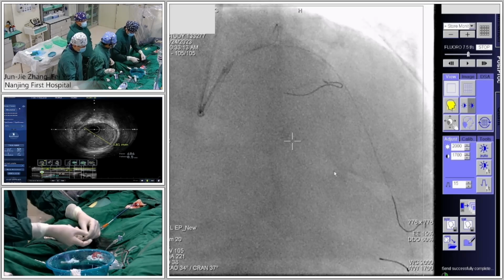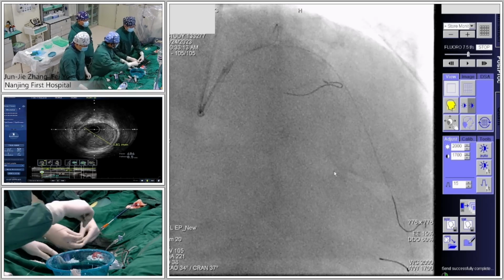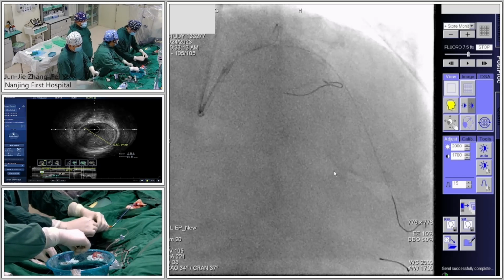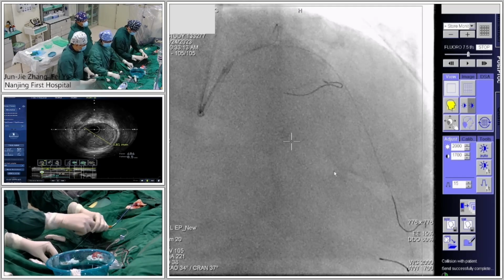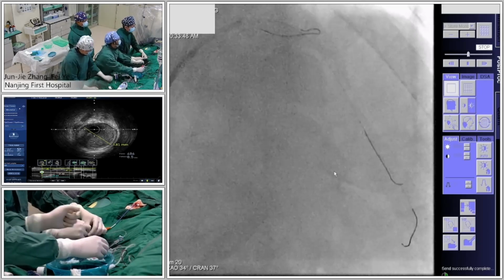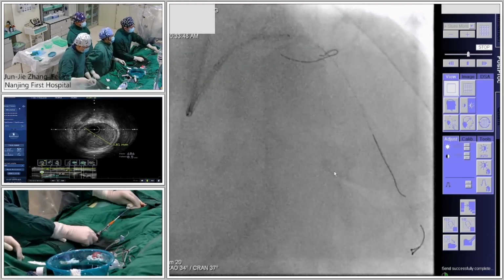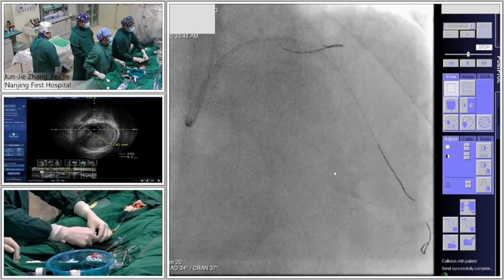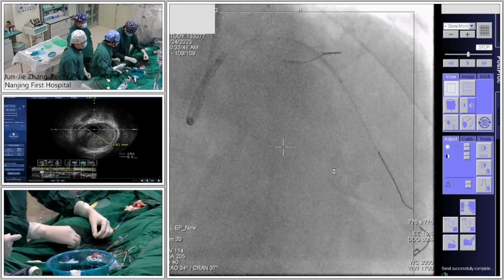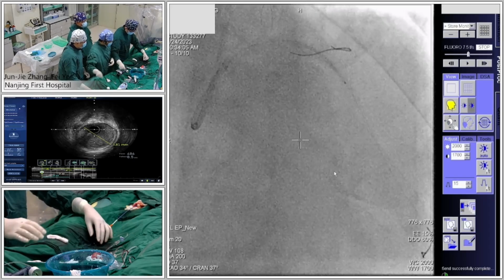Another option, I think we can also use a super support wire, like a Thin wire with a micro catheter to exchange. An extra support wire is better compared with a conventional wire, if still failed. Okay, nice. You nearly succeeded. Okay, good. I'll pull back the angulated jet wire. Okay.